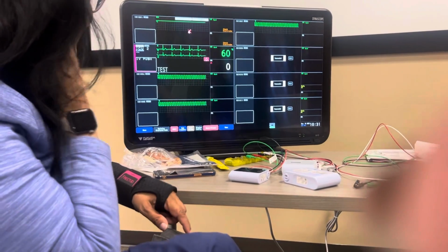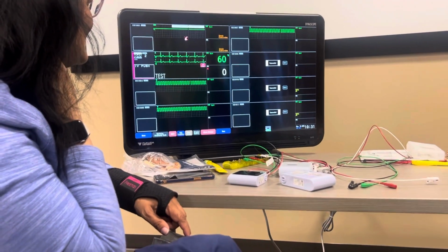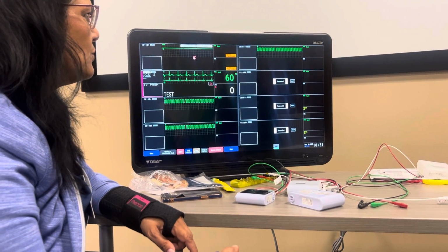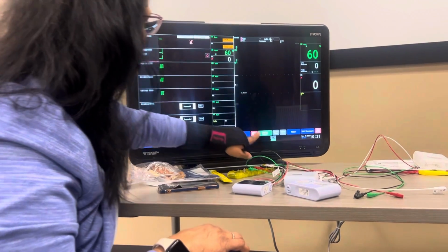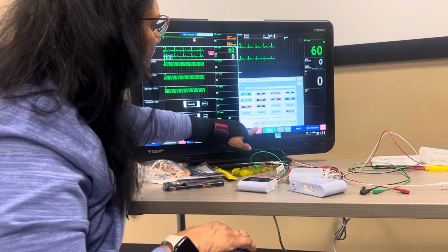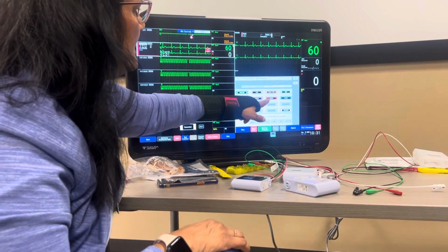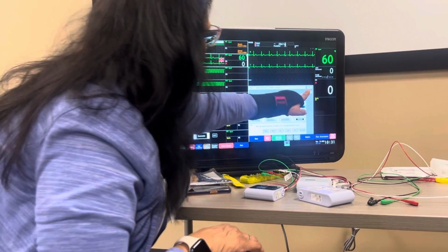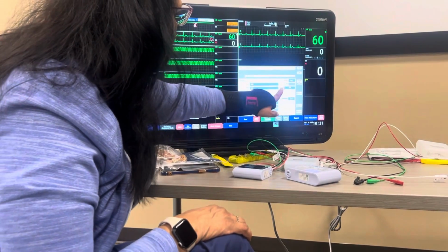Does it give you the same selections regardless of where they're going, whether it's CT, IM, cardio? That was just for the time for the walk. I think there might have been a procedure one. There is a procedure one. That's all I'd pick probably. If you only did the procedure, you can choose how long, or you can hit continuous. I can add anything that you feel like you might need. I think that covers it, because procedure covers everything else that's not on there.